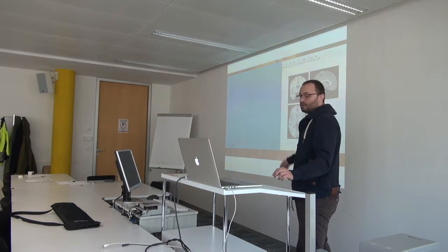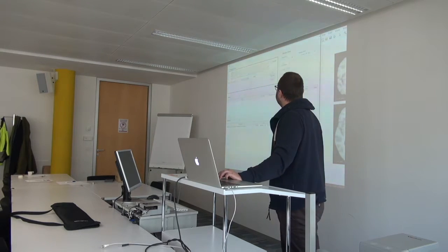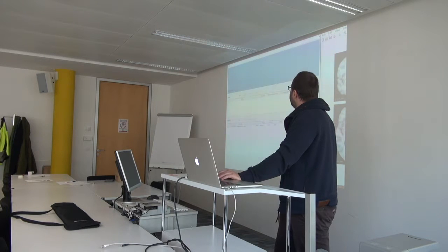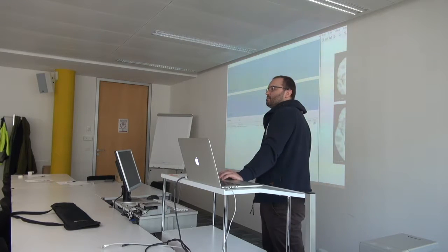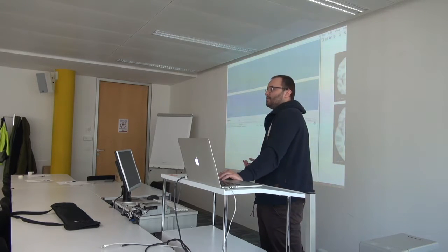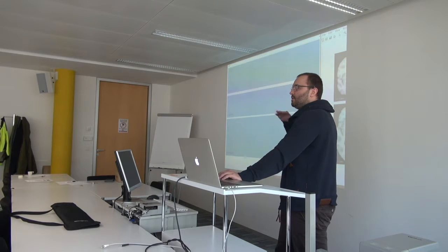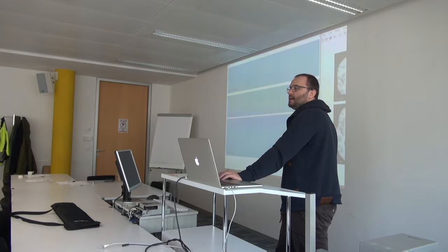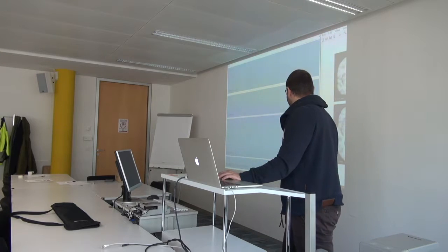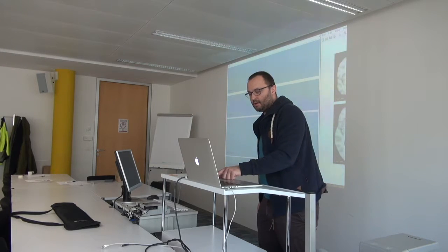It consists of a controller window and a viewer window. In the controller window, there's a pane on top where you can select the view mode. Then there's a section where you can manipulate and add labels — text labels that you add to your figures at some position, like anatomical labels. And then there is a table consisting of different volumes where you start with an anatomical underlay and then can add all your overlays and masks. There's still room for improvement, and more features will be coming in upcoming versions.